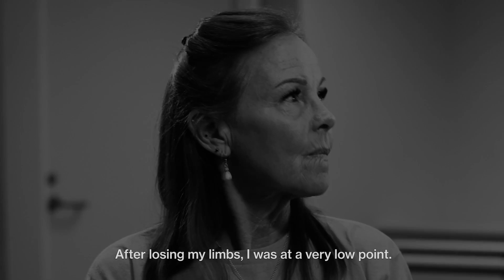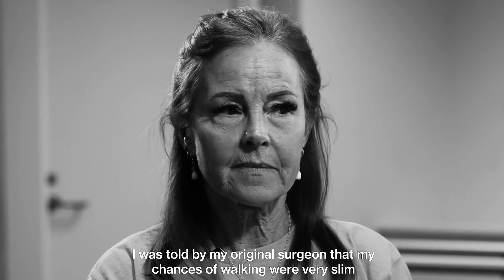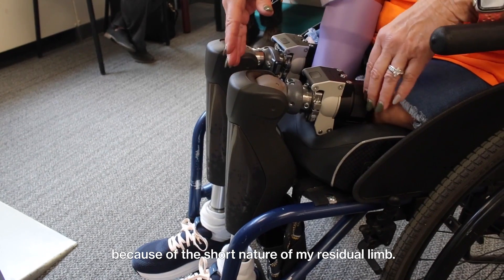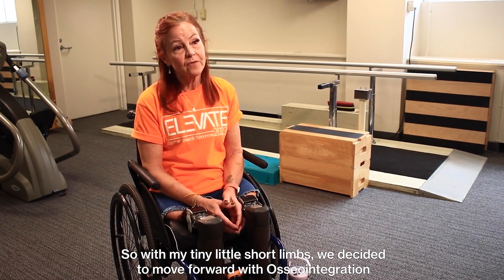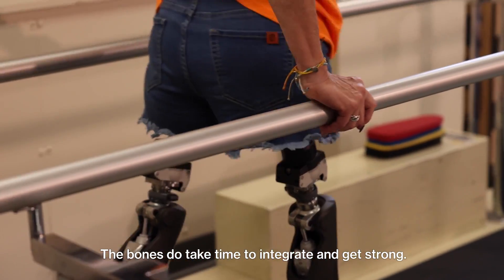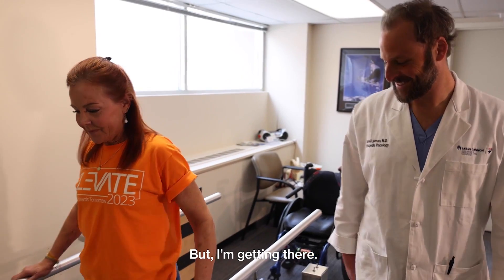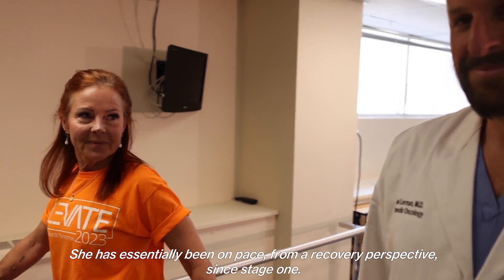After losing my limbs, I was at a very low point. My original surgeon told me my chances of walking were very slim because of the short nature of my residual limb. With my tiny short limbs, we decided to move forward with osseointegration. I've been learning that I've got to really listen to my body — the bones do take time to integrate and get strong, but I'm getting there. To nobody's surprise, Rochelle is doing great and has essentially been on pace from a recovery perspective since stage one.